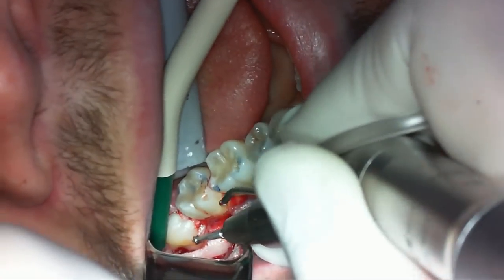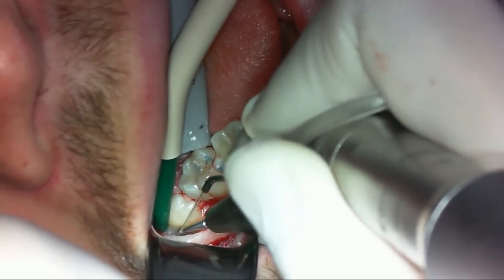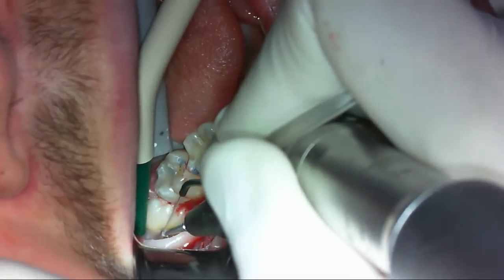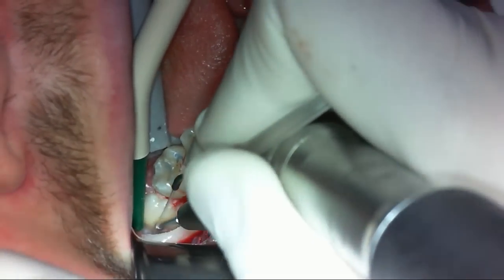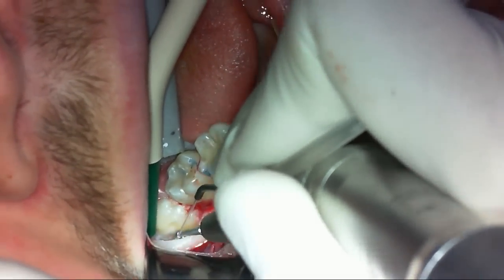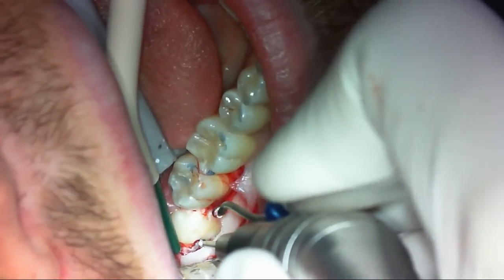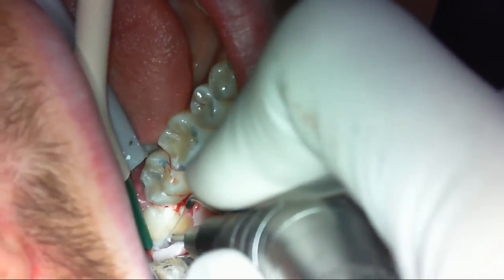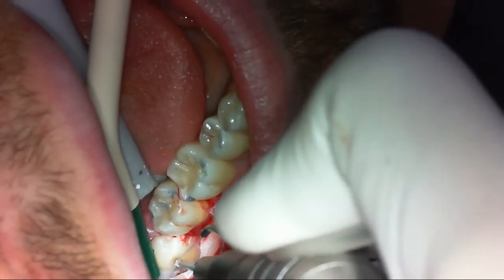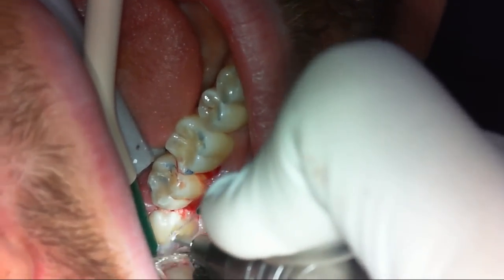When sectioning with a straight handpiece, don't start from the enamel — start from the cemento-enamel junction because you'll have minimal resistance at 40,000 RPM with the slow speed. What I do is get my round bur into the pulp chamber — it's like doing an endodontic access but from the buccal side. Once I expose the pulp chamber I can orient myself, knowing how far apically and coronally I need to go.